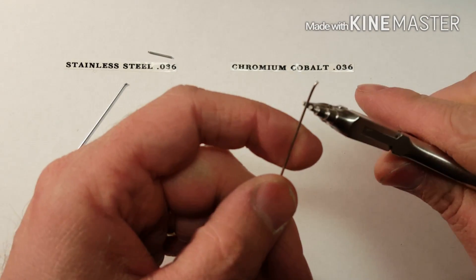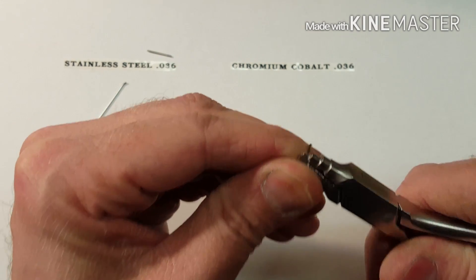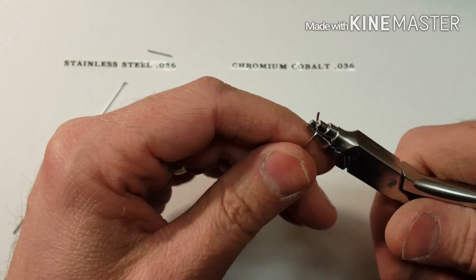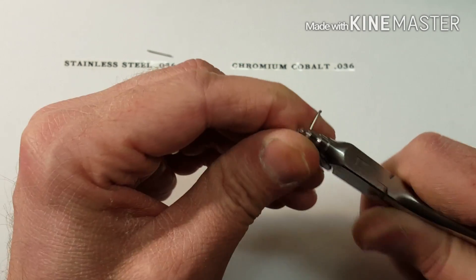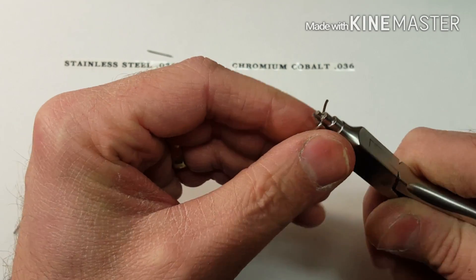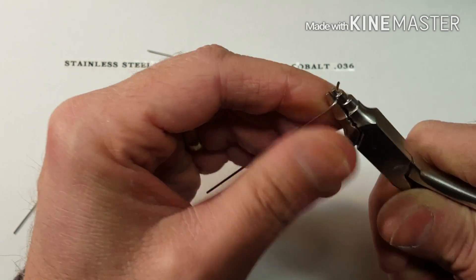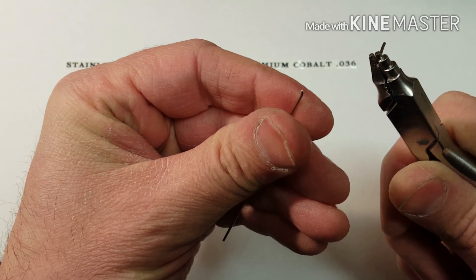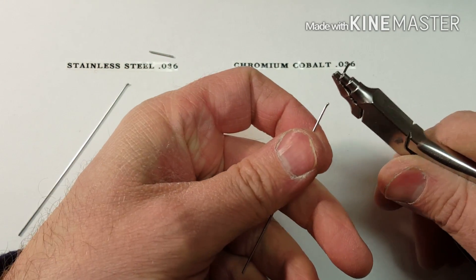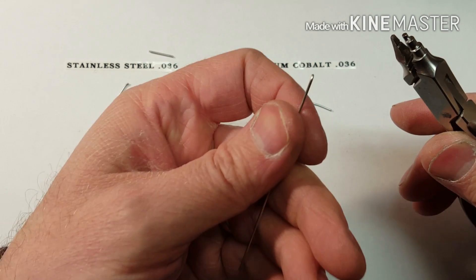Now, with chromium cobalt wire, I'm going to demonstrate this exact same thing. 1 bend, 2, 3, 4, 5, 6, 7, 8, 9, 10, 11, 12, 13, 14. So you can clearly see that you can bend it 14 times before it actually fatigues. I'm doing the exact same 90 degree bend.